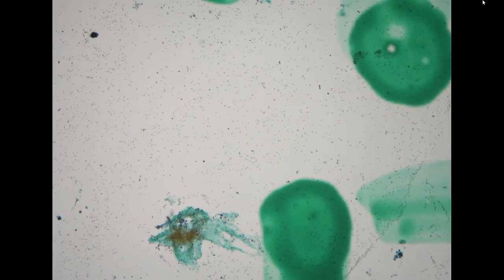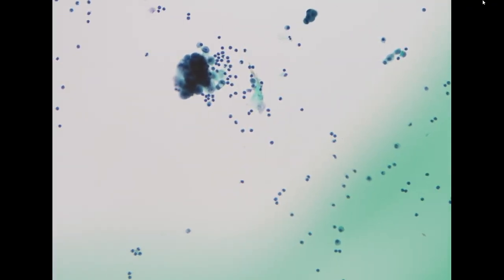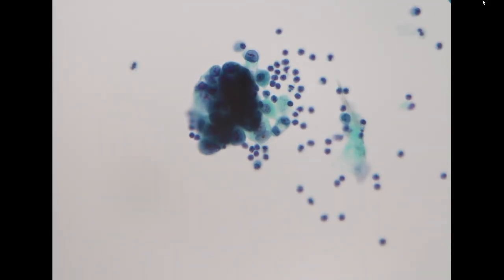So the next specimen, this is from pleural effusion. The patient had a confirmed history of renal high-grade urothelial carcinoma, and it seems to have directly invaded into the pancreas, an adjacent organ. And now this is suspected to have pleural seeding as well.